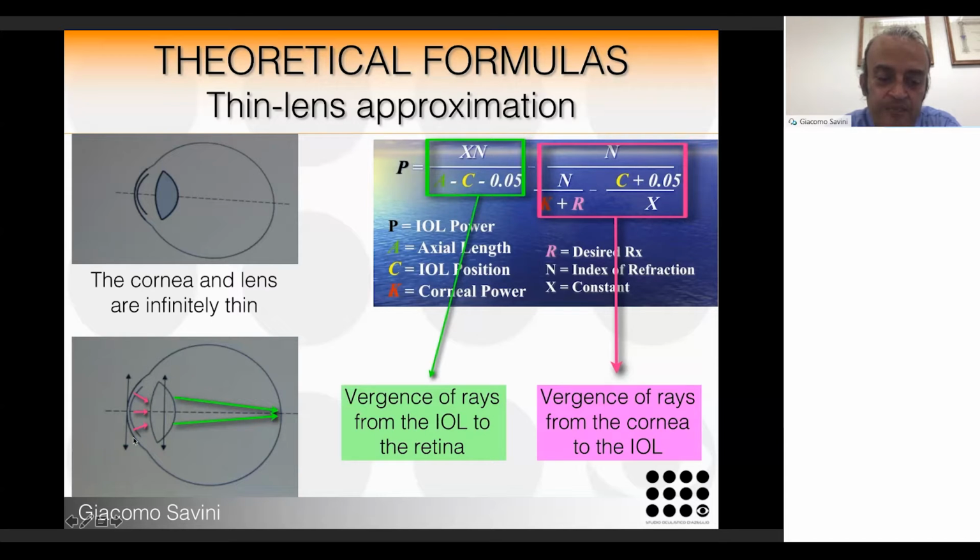So here we have about 70 diopters, then you have about 40 diopters, or 45, sorry, and then you have to subtract what happens behind the lens. Where do all these formulas have a difference? The difference is this term that Hoffer calls the IOL position. That is what we are used to call the ELP, the estimated or effective lens position, which is different in each formula, because more or less the corneal power and the axial length and the refraction and all the other data are very similar. There are small differences, but very small.